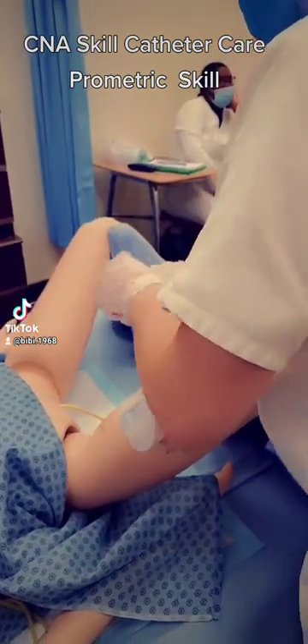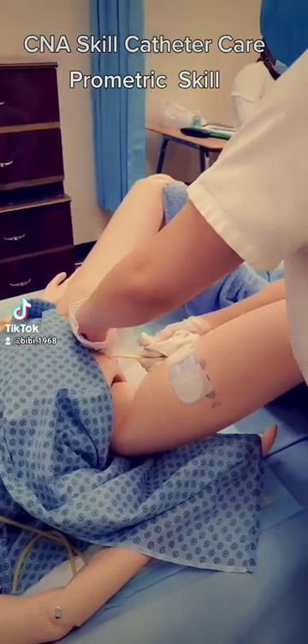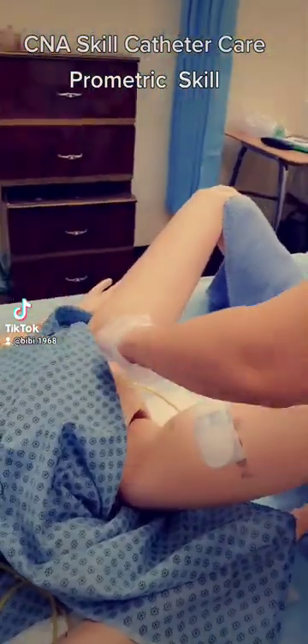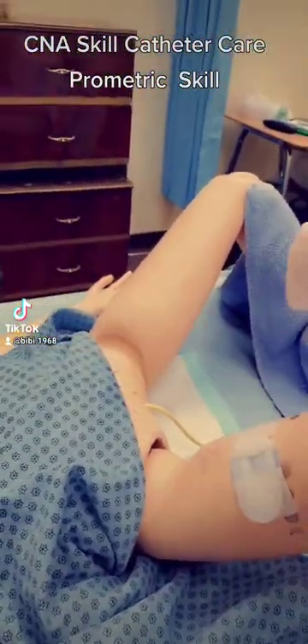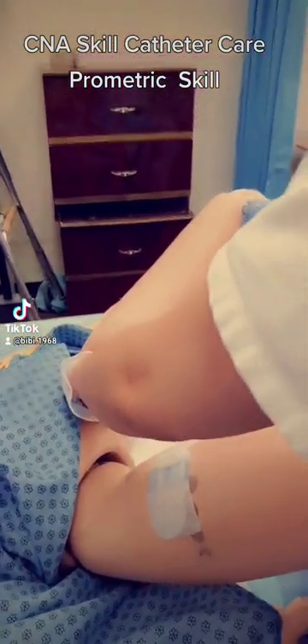Then I pull the first corner down, swipe second, two, making sure not to pull on the catheter itself, three, and my last corner, four.